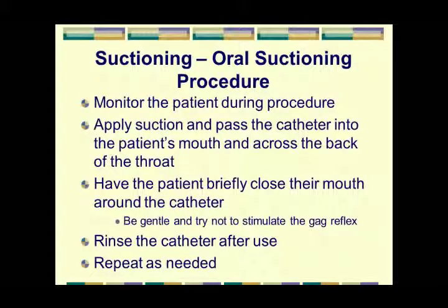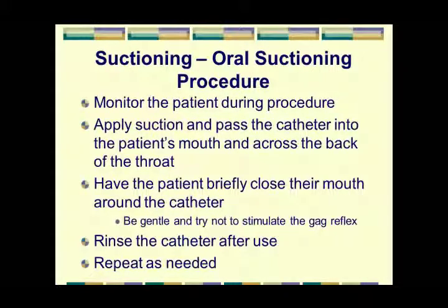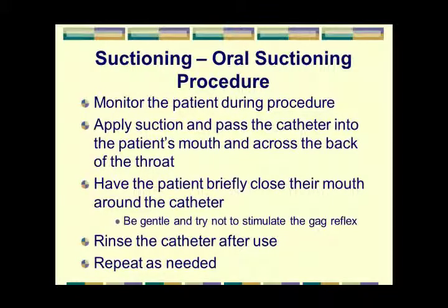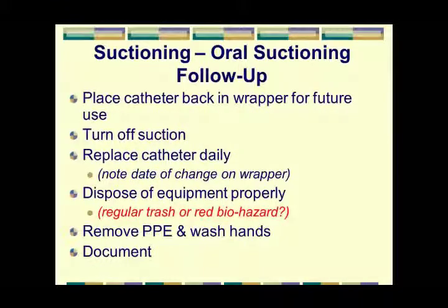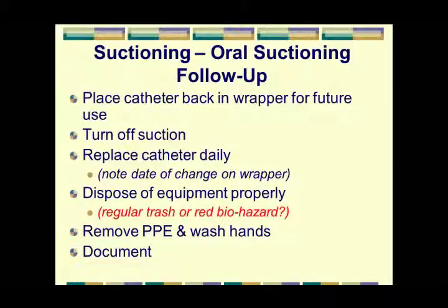You guys have all been to the dentist, right? Put your mouth around the thing and clear out your mouth. Same idea. Then rinse it and repeat as necessary. All through this, we're monitoring the patient for respiratory distress or hypoxemia. Okay. Once it's done, some of the systems are really slick. They actually have an outer sheath that slides open and closes over it so that it's protected.